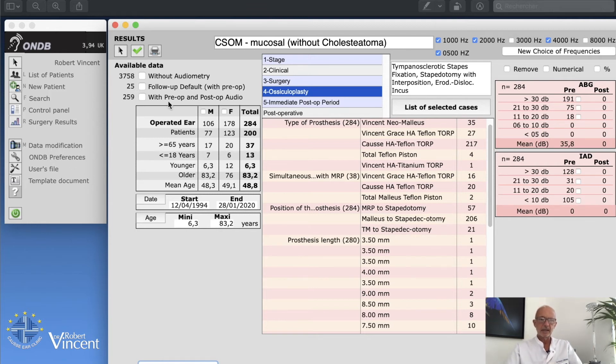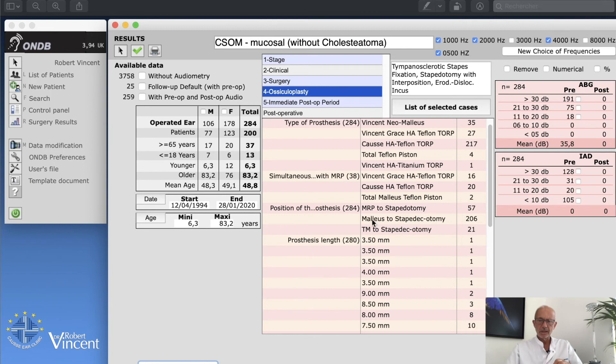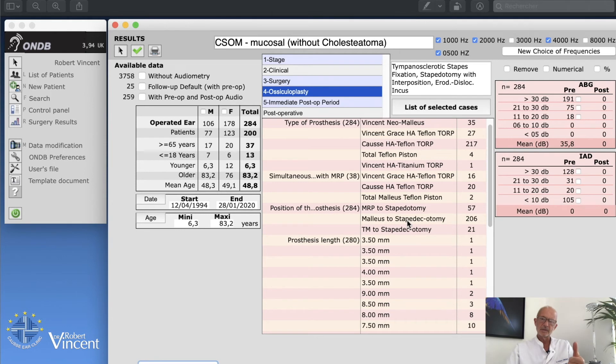If you want to study your results, you can export that directly by clicking with pre and post-op. But I think it would be interesting to be more specific. So I just want to click on malleus to stapedotomy. I want to study my results in case of tympanosclerotic stapes fixation.